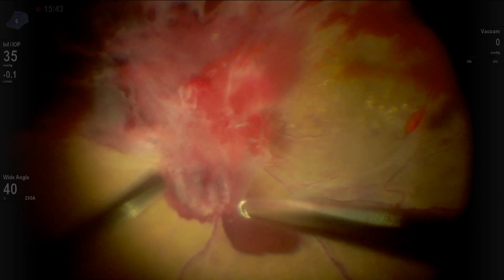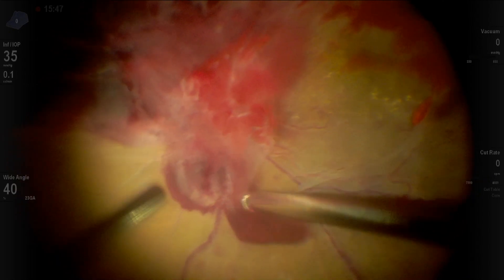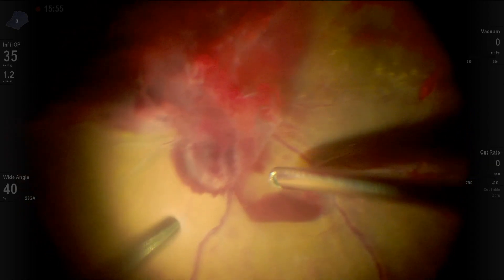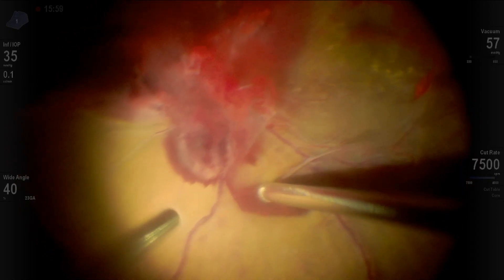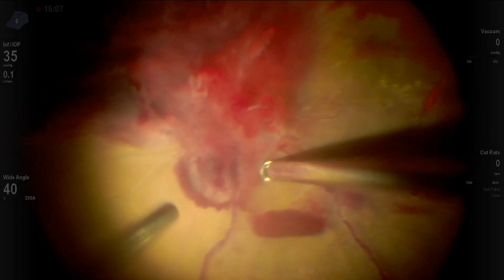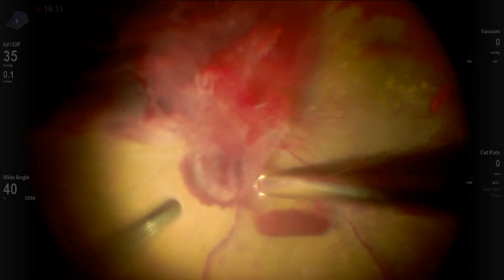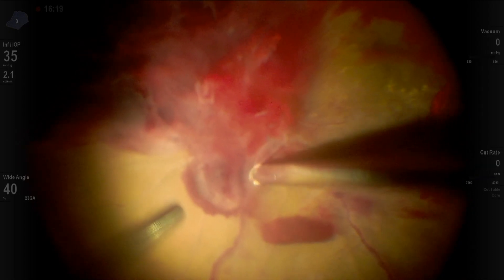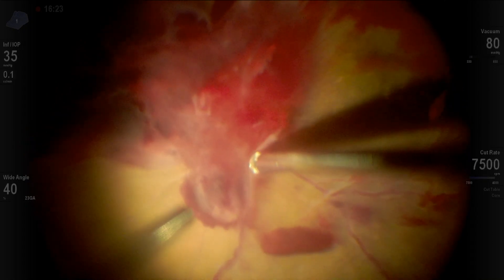Now here we're just testing the water, seeing what's happening. This is a good dissection area over the hemorrhage. We want to go back and work over the disc and move from there very soon. This is the case I operated with my fellow Dr. Riley Sanders.